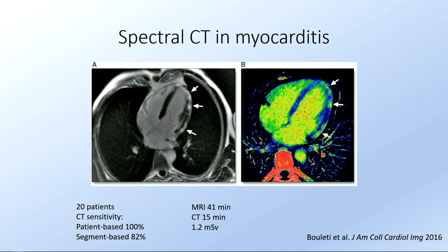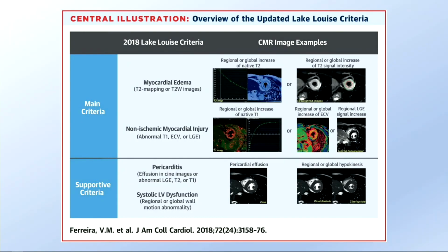So it doesn't always look as good as we see in many of the pictures. So Spectral, I think, like I showed you a case that it wasn't that nice with the traditional, but it looks very good with Spectral. So how to make the diagnosis from CT can be also a little bit challenging, but we can still do it.